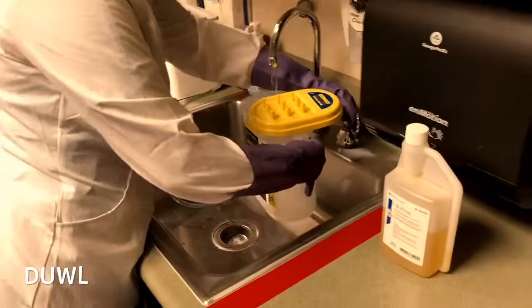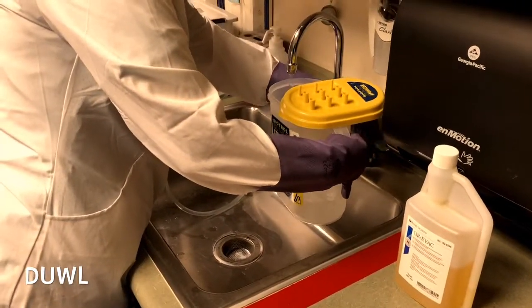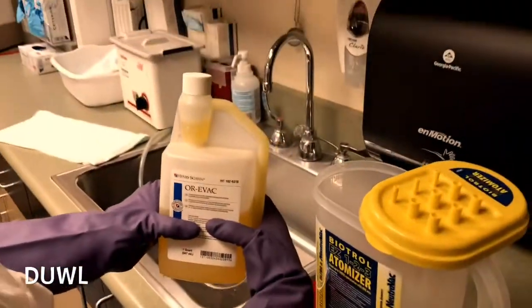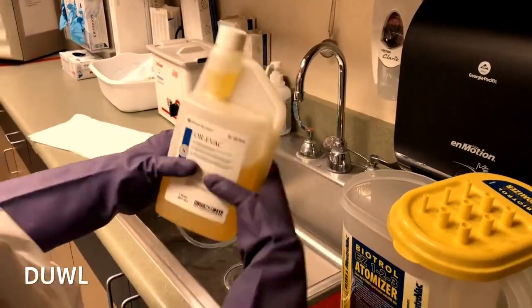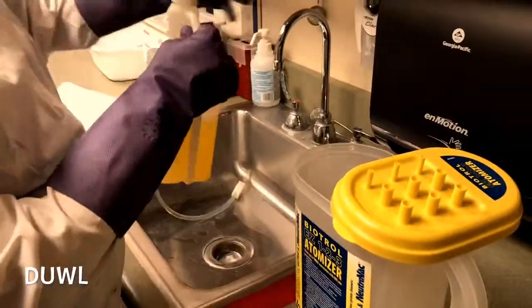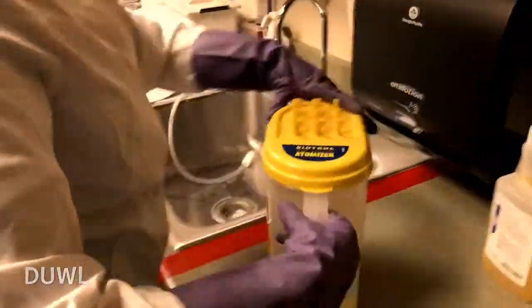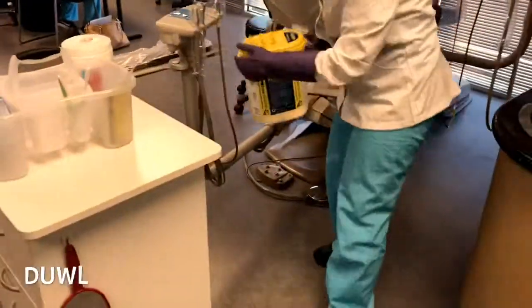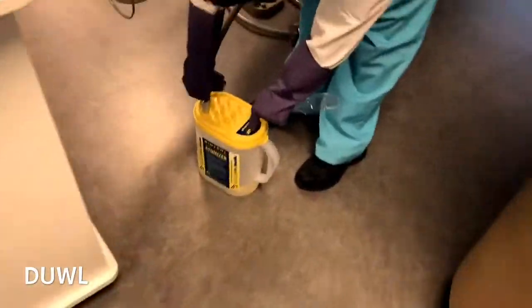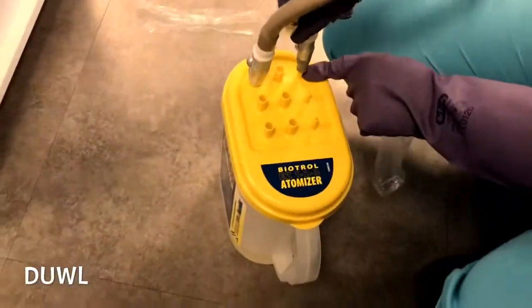Now Ali's getting ready to flush down the water lines. She's filling it up with 1 quart of water and ½ ounce of our evac solution. And here we get our water lines and we're going to connect them. And after we connect them, we turn them on so they could start flushing.